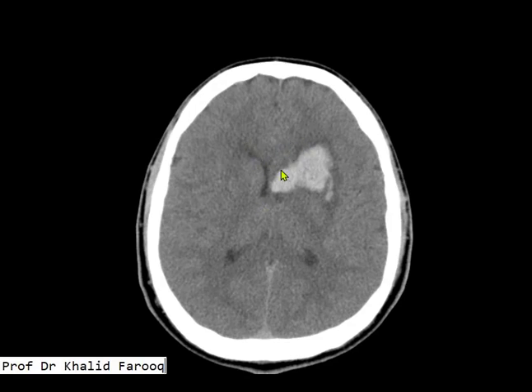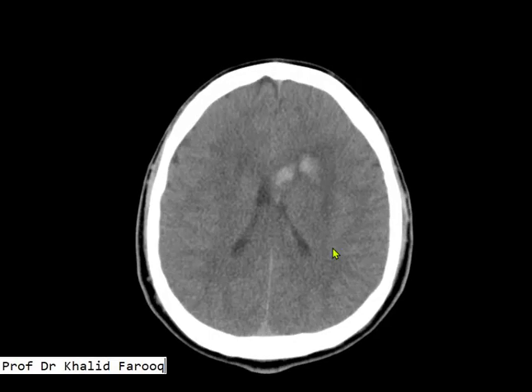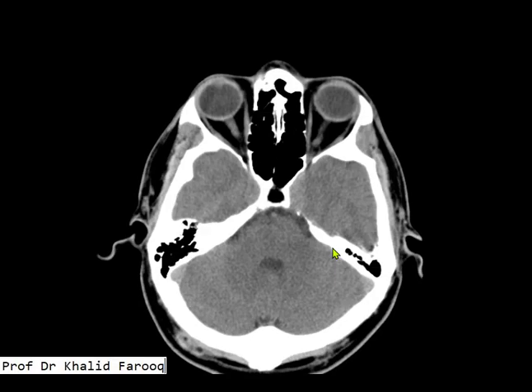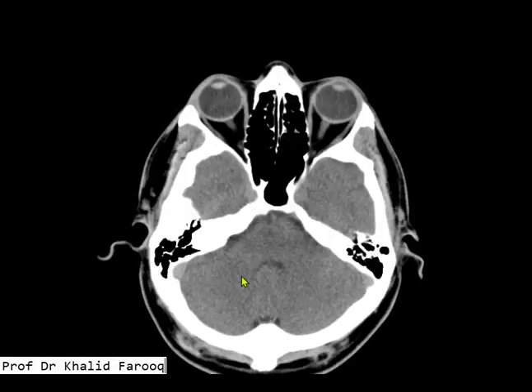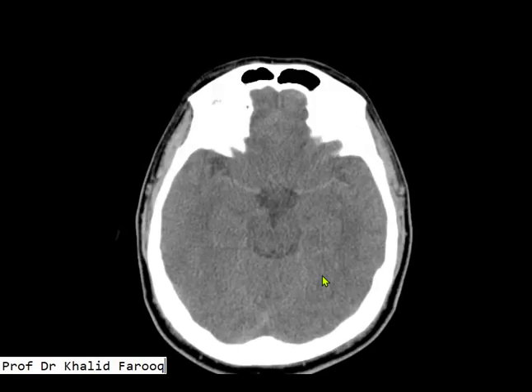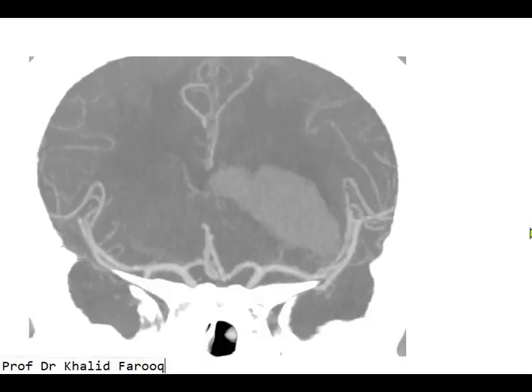while we are unable to see the left frontal horn because of mass effect on it. The remaining brain parenchyma including the brainstem, fourth ventricle, CP angles, and cerebellum is unremarkable. Let's look at the CT angiography.